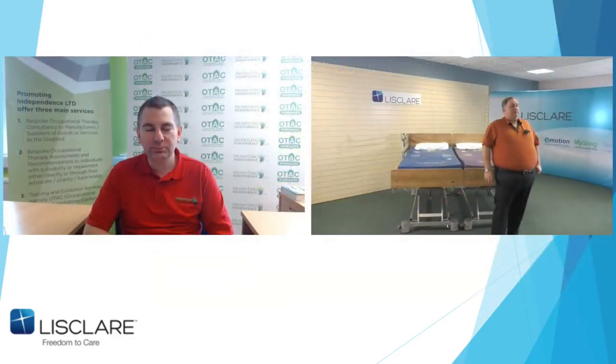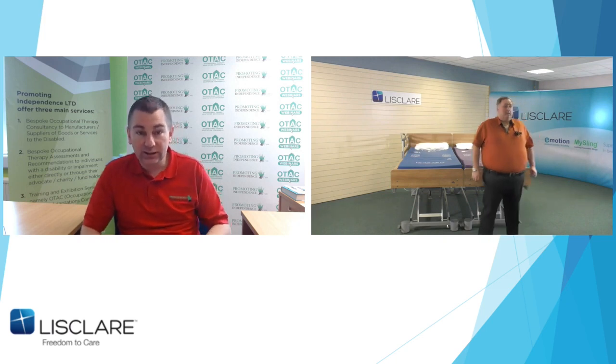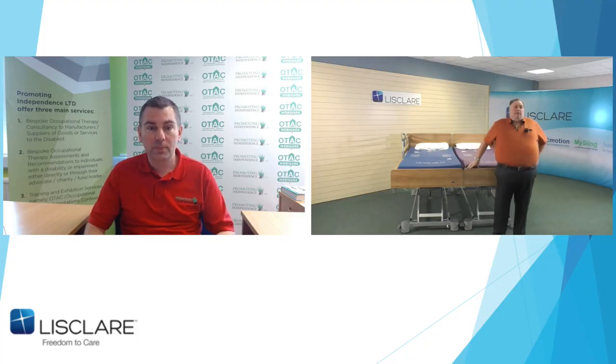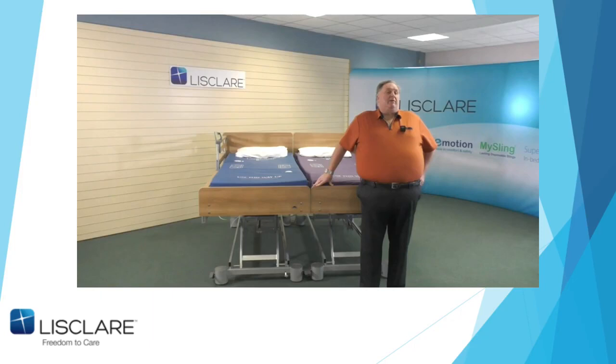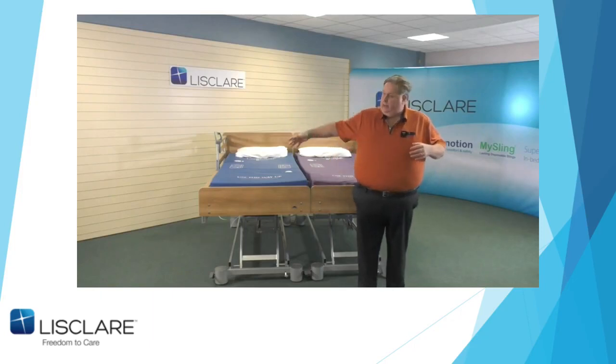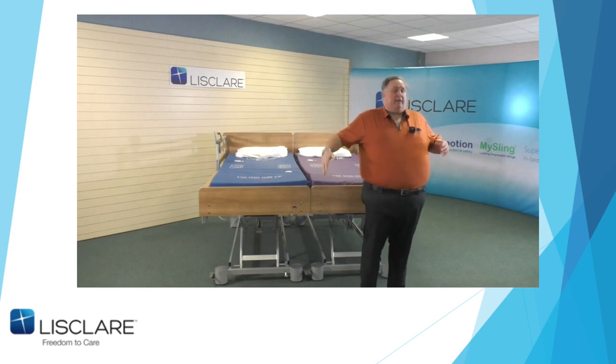Fantastic. Keith, if somebody's having an extension built, do you think there's justification, if you are putting this type of bed in, to ask for a larger extension? Yes, it just gives you space. Obviously, you have to have the hoist space considered if it's a mobile, if you're bringing a mobile into certain space, and you need to be clear.